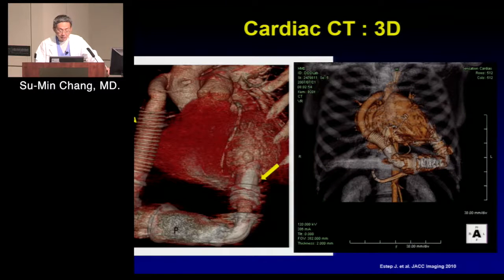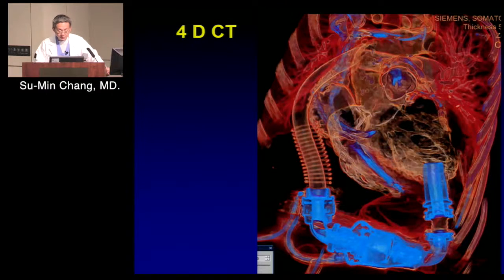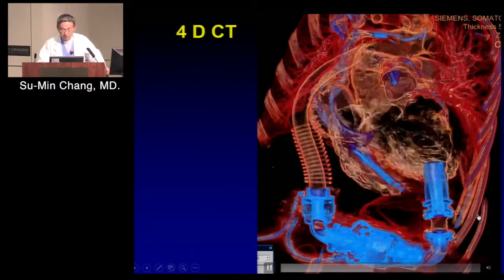Okay? And this is the images that we generated years back in one of Jerry's review articles in JACC Imaging almost 6-7 years ago. Okay, I believe the one on the right hand side, this image is basically taken from older scanners, and it looks good, but now with a newer CT, we can do 4D CT. I'm not so sure what's the clinical utility, but it certainly looks nice.